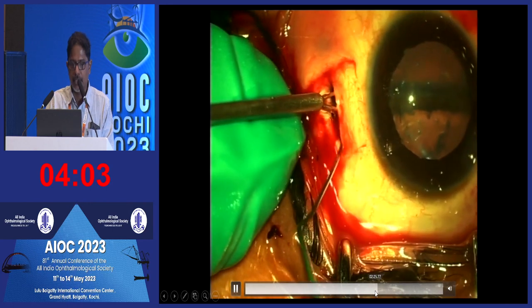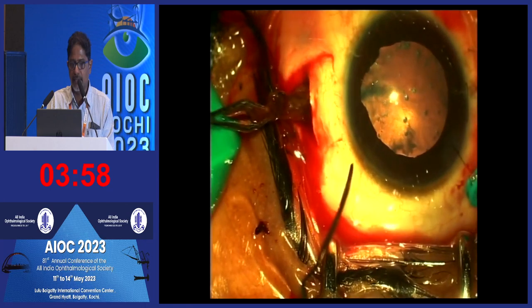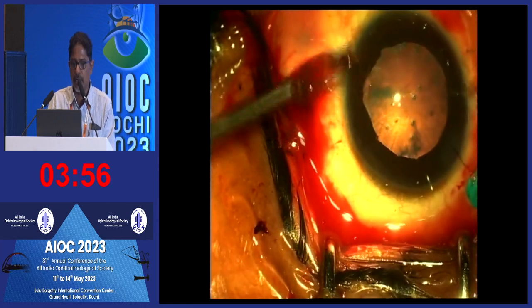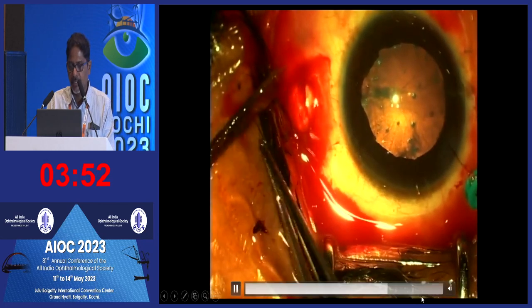And using the cyclospatula to mobilize the foreign body for easy exit. So that's the first case, where we removed a long stick from the intravitreal space.